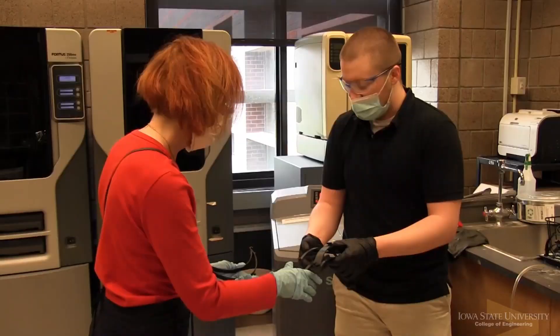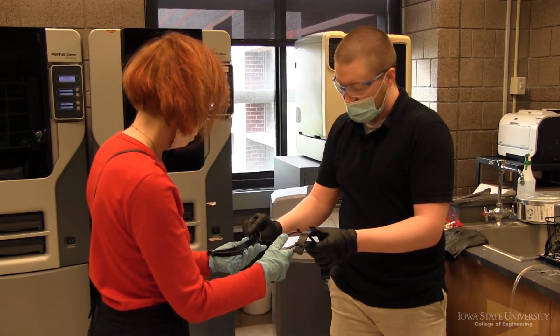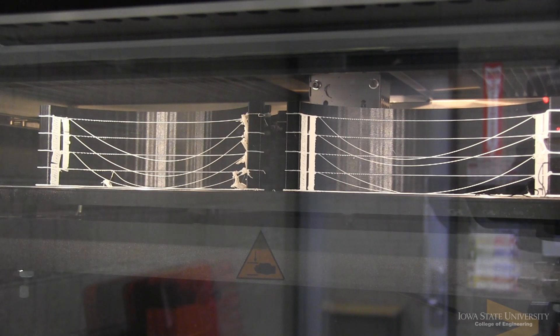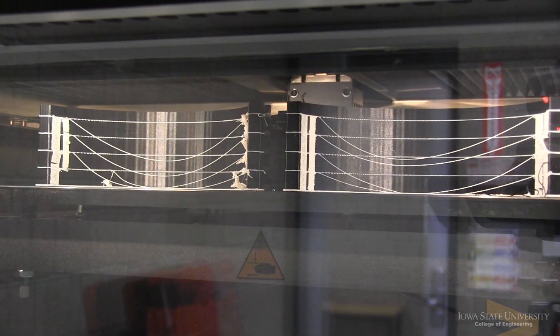Part of the university's mission is outreach to the community — we're here to help the community. So the effort we're doing in this lab is part of the university-wide effort to use our 3D printers as much as we can. In this case we're producing face shields.